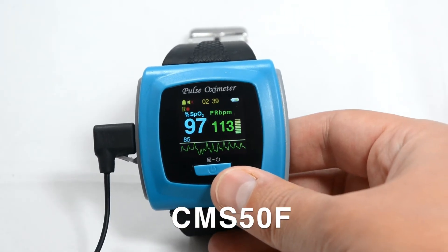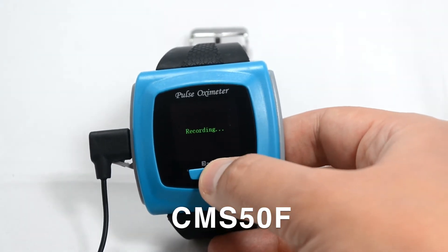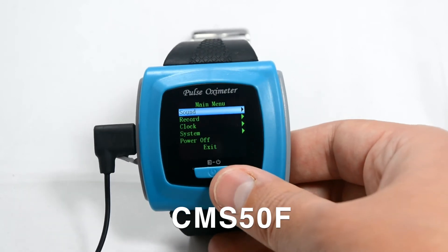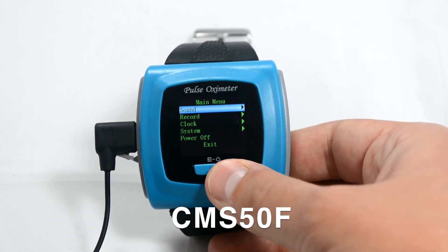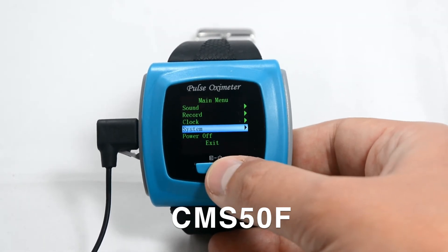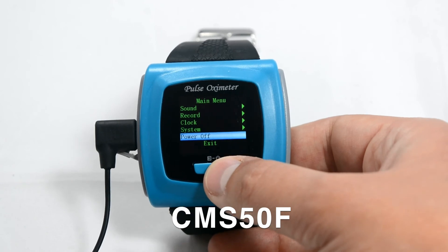To reach the menu on the device, press and hold the power button. You can choose from sound, record, clock, system, power off, and exit.